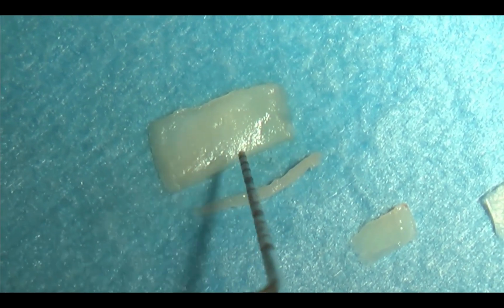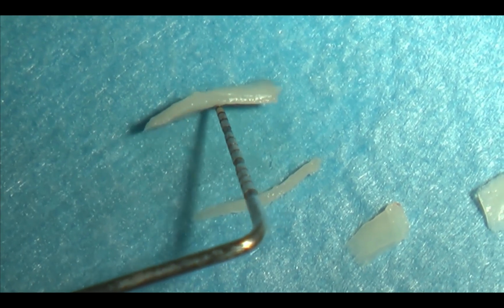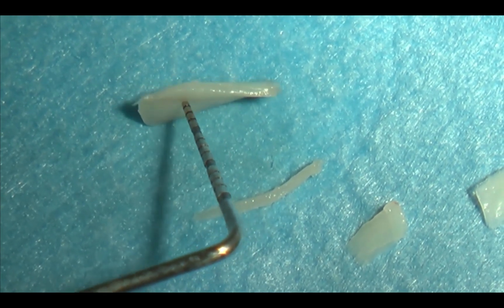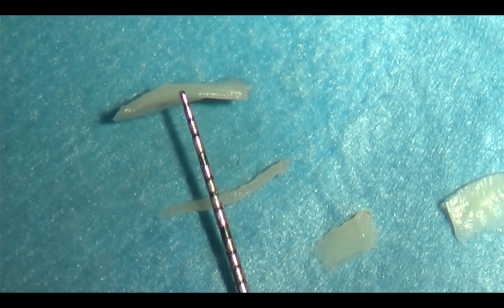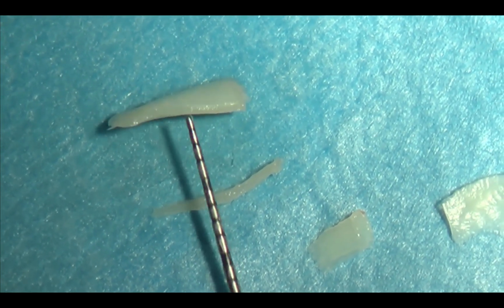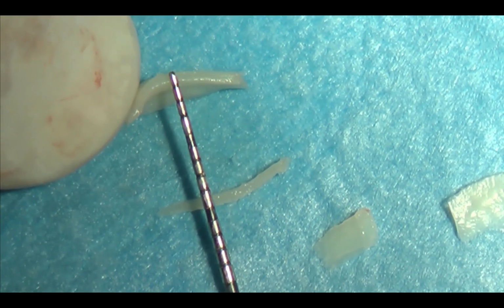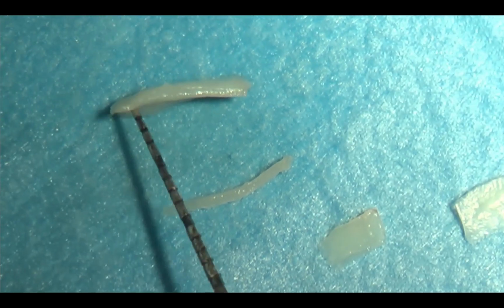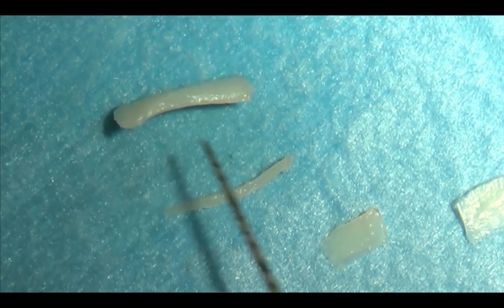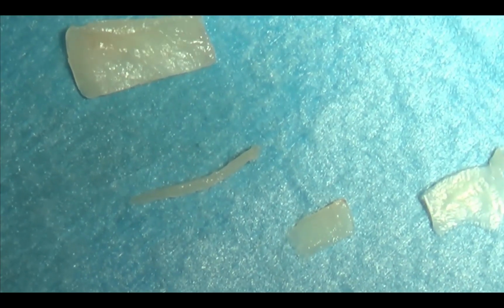Now if you look at the graft from the occlusal aspect, you can see that it's exactly the same from the mesial to the distal, and its thickness is about 1 millimeter, even less. It is less thick in the periphery where we are going to place our graft at the level of the papilla.